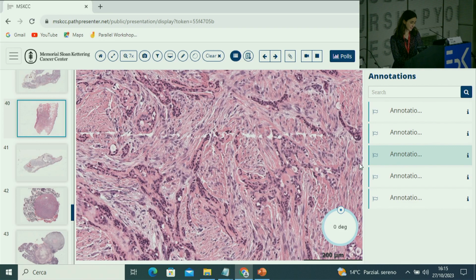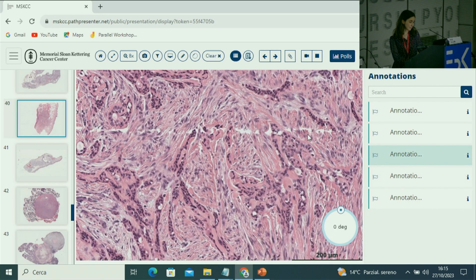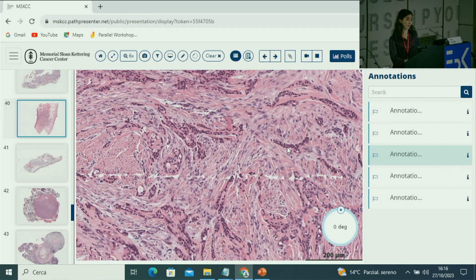Yeah, hyalinizing clear cell. So, it is a hyalinizing clear cell, but I agree, like mucoep, it's one of the main differentials. Mucoep's differential is hyalinizing clear cell in view of the clearing that you can see sometimes in mucoep, and also keep in mind that you can see focal duct formation and even intracellular mucin in hyalinizing clear cell carcinoma. So especially small biopsy, sometimes very hard to tell them apart because mucin can be focal also in mucoep, like the case I showed.